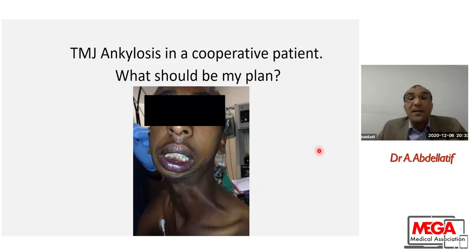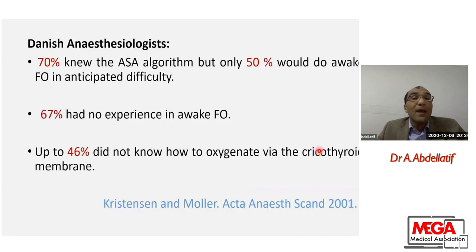One of my colleagues suggested that I have to go with an awake nasal fiber optic intubation for this patient as a safe option. What if I am not mastering the fiber optic? Maybe I will think about unsafe options. Maybe I will think about awake tracheostomy under local anesthesia. This is very invasive to the patient. Maybe I will try to put the patient asleep or make a blind nasal intubation, which is a blind technique with its complications. Maybe I'll cause bleeding. Maybe I'll make the condition worse.